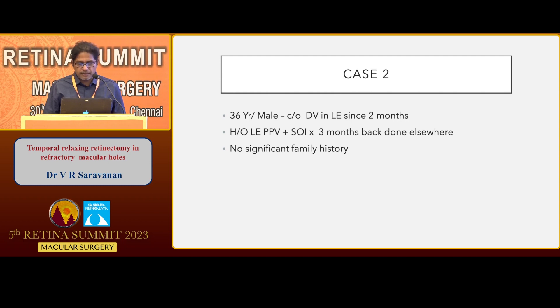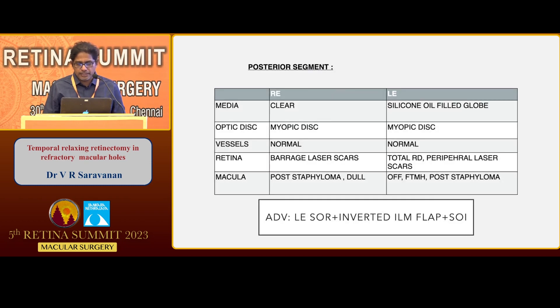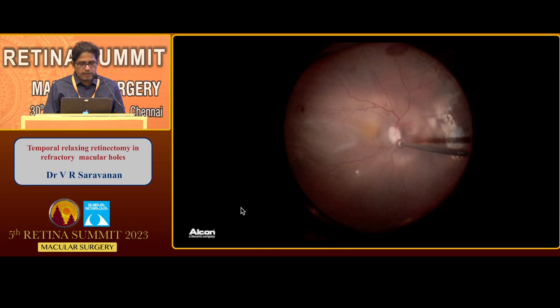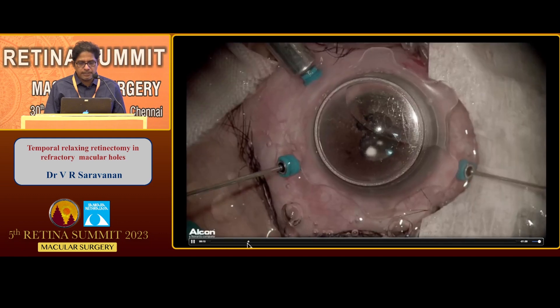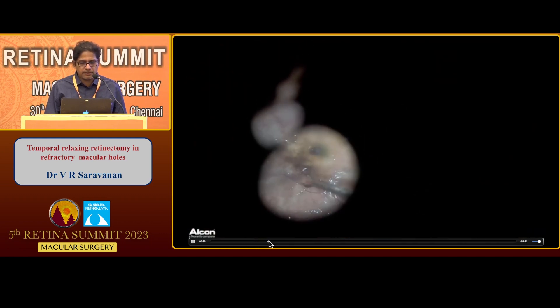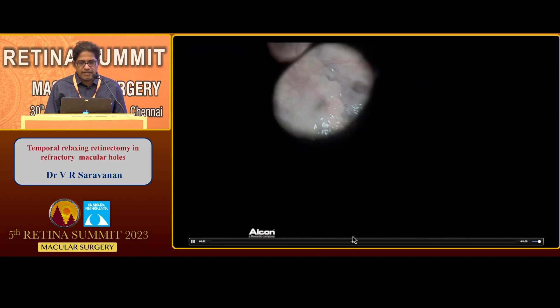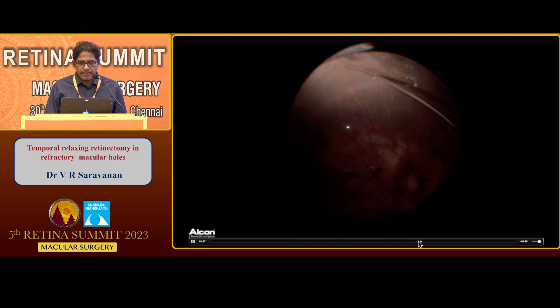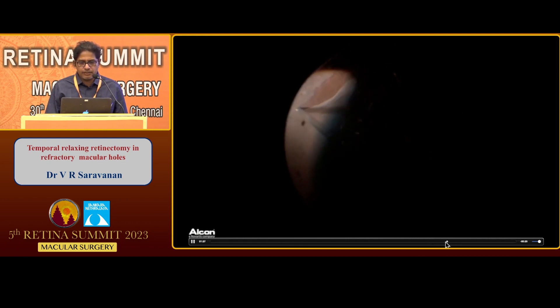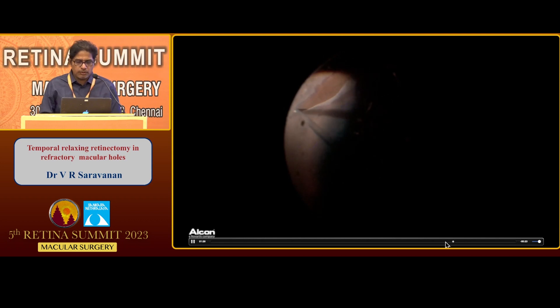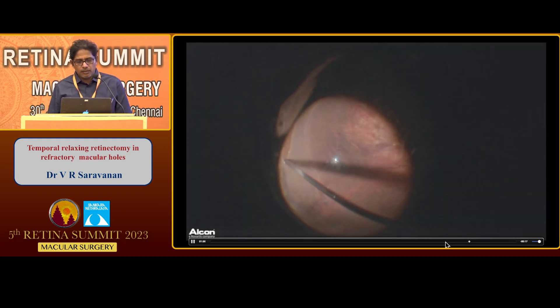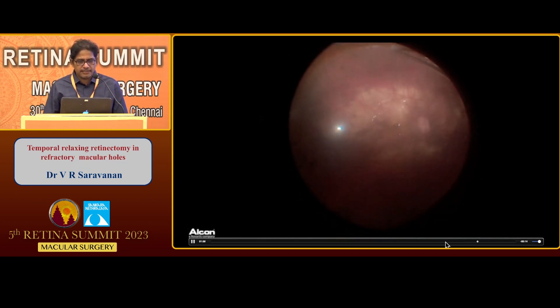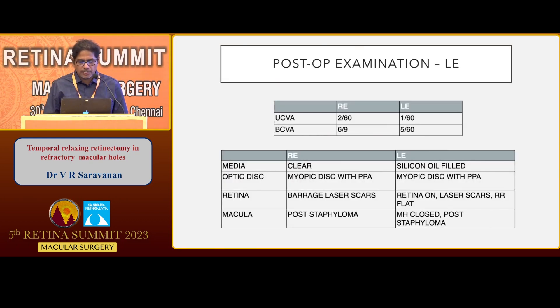There's one more case where the patient developed a recurrent RD under oil after silicone oil removal and I could not make out any break other than the macular hole. This is a post-SOR recurrent RD in a high myopic patient with an open macular hole. I assumed the macular hole is the cause of detachment in this patient. Here I was able to successfully harvest the ILM, so I did an inverse ILM flap and went on to do the temporal retinectomy — also doing inferior retinotomy to prevent vitreous base contracture. Going for almost 180 degrees or more, around 200 degrees of relaxing the retina, this led to successful closure of the hole as well as attachment of the retina.